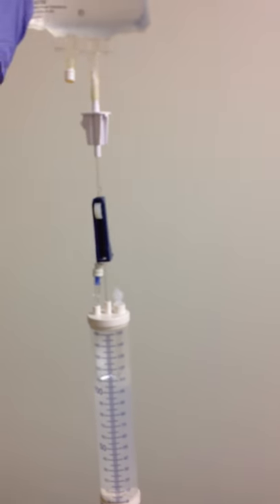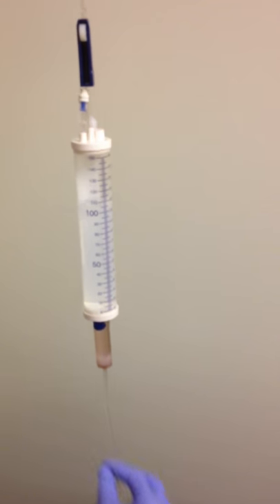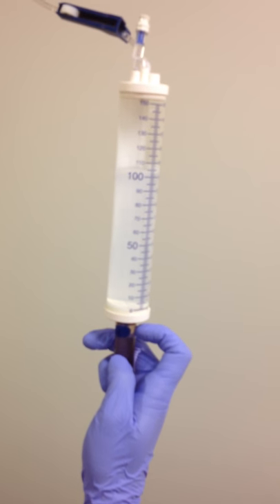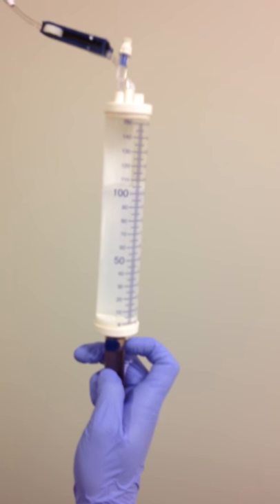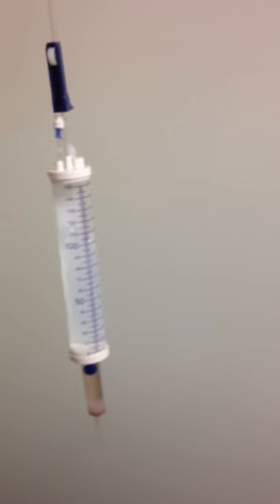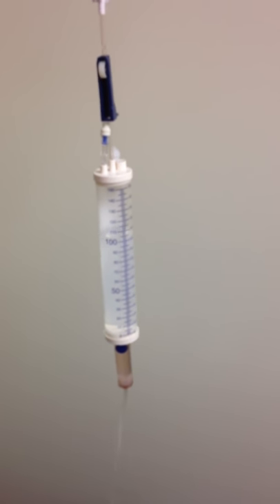Now we have our correct dose of amiodarone in 100 milliliters. We will open the thumb wheel to the patient to allow for it to drain. In our drip chamber, we'll see the drips, and that's how we count to see how much amiodarone is given, so we give the correct amount over the 10 minutes.